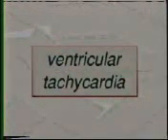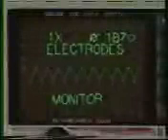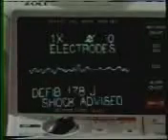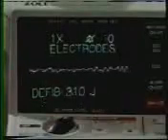Another rhythm disturbance that can occur is ventricular tachycardia, or VTAC. In VTAC, the heart can beat at too fast a rate to sustain life. Basic CPR cannot convert hearts in VFib or VTAC to normal rhythm. For this, electrical defibrillation must be used, but the probability of successful defibrillation decreases 7 to 10% with every minute that defibrillation is delayed. The goal is clear: to provide electrical defibrillation where appropriate as quickly as possible.